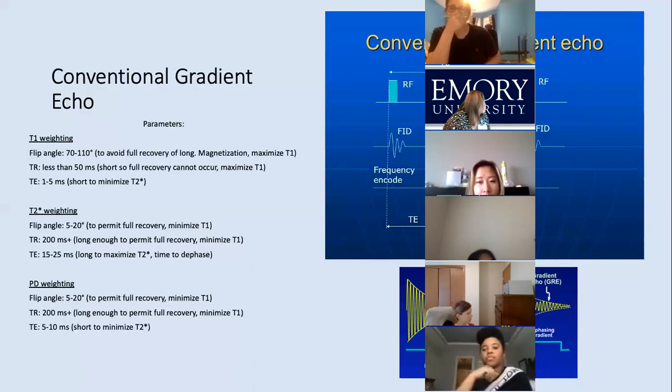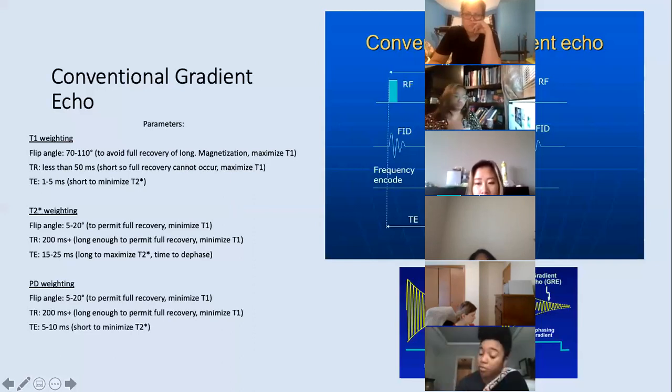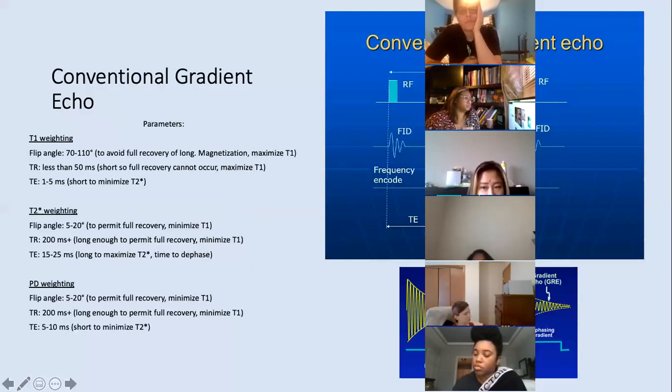Okay, a good question. A lot of the times when the SAR pops up, we go to first level too, unless, Tisha, you are dealing with some kind of metal or device in the body, or a pregnant patient. Because remember, when you go to first level, you're potentially putting more stress on the patient.